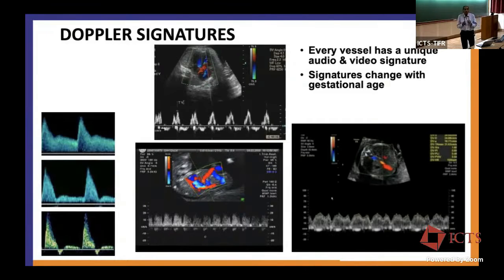Now, there is an opportunity here for us to completely automate this measurement. At present, it's also available, but in real time, not only to automate, but also interpret it to see what is the kind of pressure change that's happening. In places where the right atrial pressure is increasing, a warning can come up saying, this baby has got a right atrial pressure increase, so better watch out for something which you need to do.